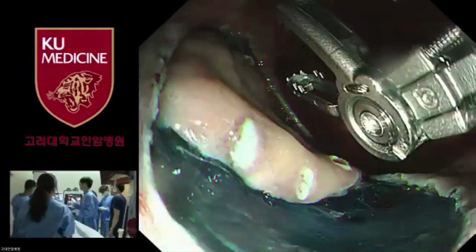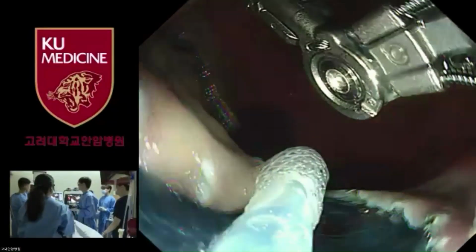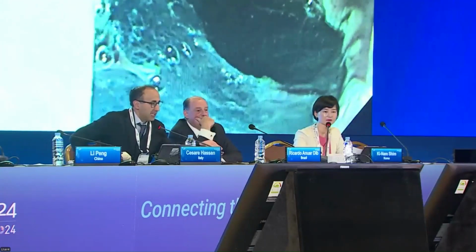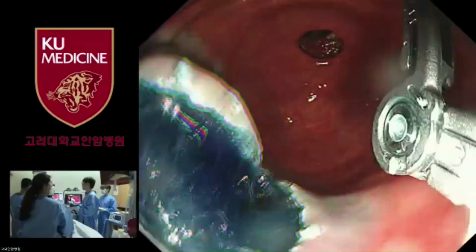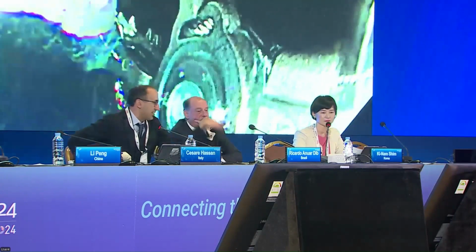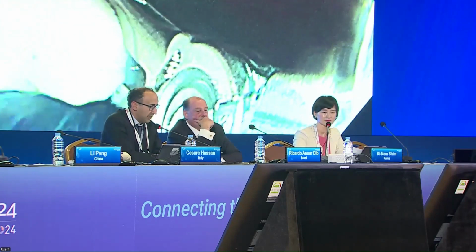Yeah, actually the robot looks like another hand inside of the patient's stomach. Yeah, right. The endoscope is another hand over there. No, but it's important that he doesn't keep the lesion lifted all the time. He lifted, then he leaves, he lifted, then he leaves. So you must be very dynamic also with the robot. It's not just one procedure. And anyway, you need lifting. This is new because, for instance, a surgeon would not need lifting. After the surgeon lifts, he cuts. We still need lifting to separate the muscularis from the lesion.